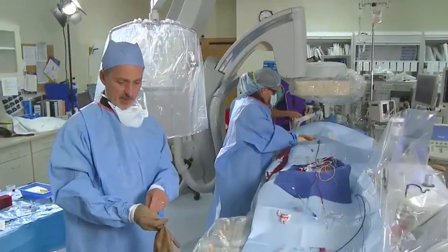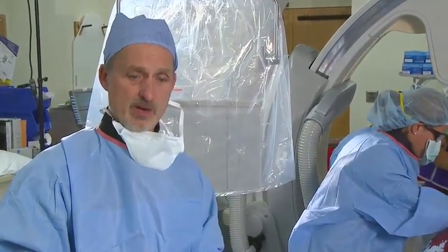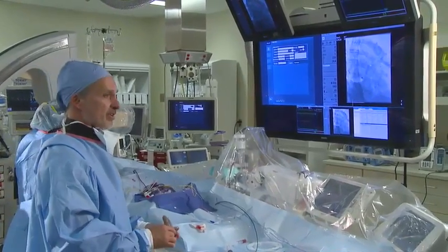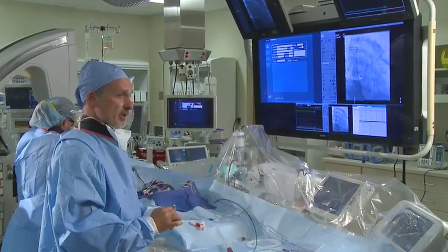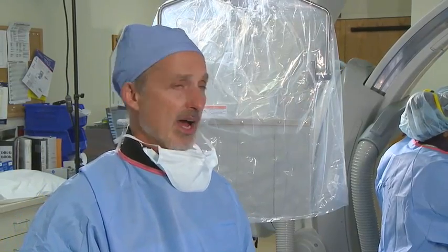So what we wanted to demonstrate with this case is the integration of ultrasound into the procedure room to guide structural heart disease interventions. And it's both an integration of technology as well as an integration of another team to allow us to do these efficient structural heart disease interventions.